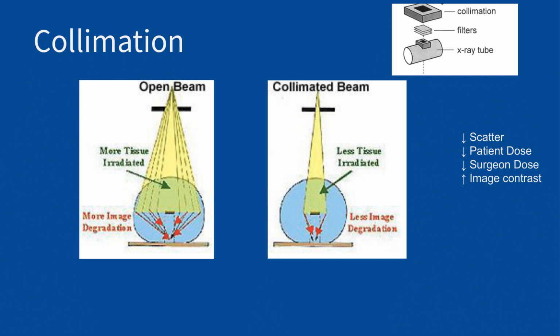But an additional advantage is that there's less scatter production, and the scatter again is what hits the operator. And with less scatter comes also better image contrast. So it reduces the dose to both the patient and the operator, and gives us a better image.